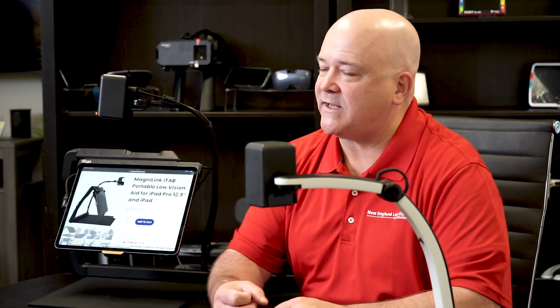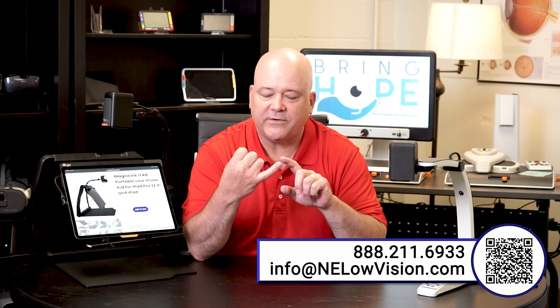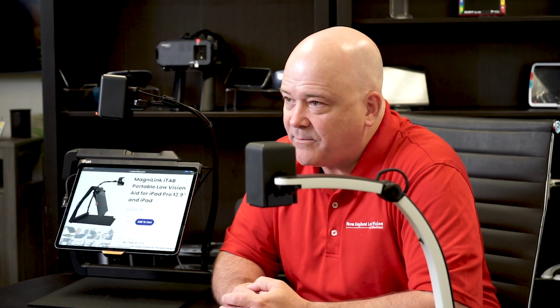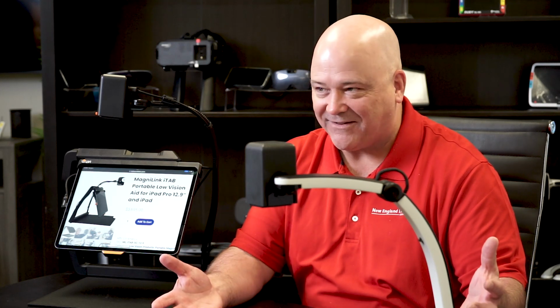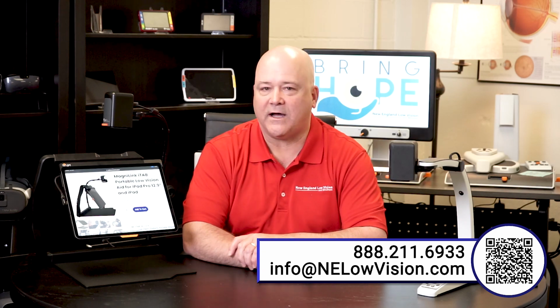So now students and professionals have a device that can connect to all their mediums: PC, the Mac, the Chromebook, and the iPad. And when you're using it with the iPad, you can use it either as a standalone system, like your MagniLink S, which you may already have, or with the stand here on my right with the MagniLink iTab.